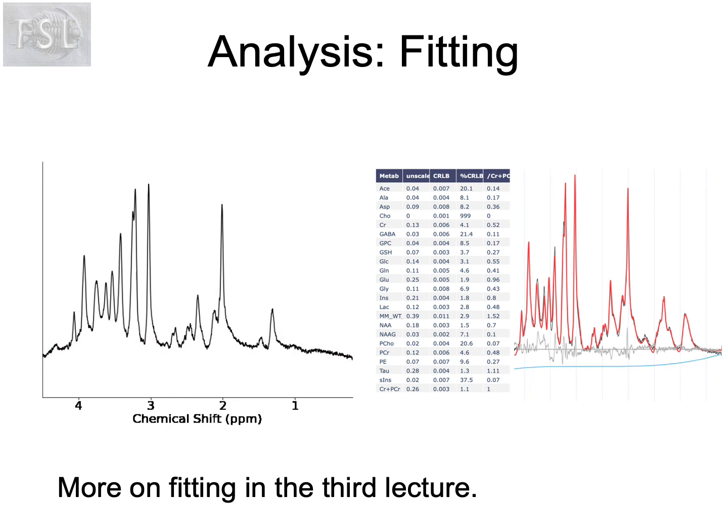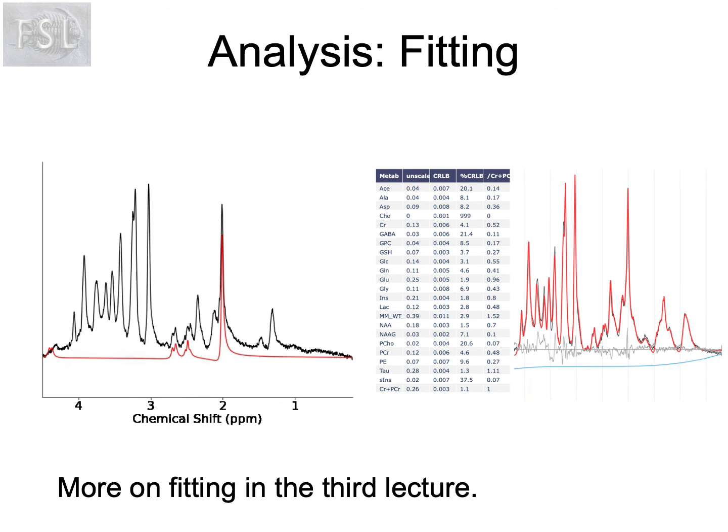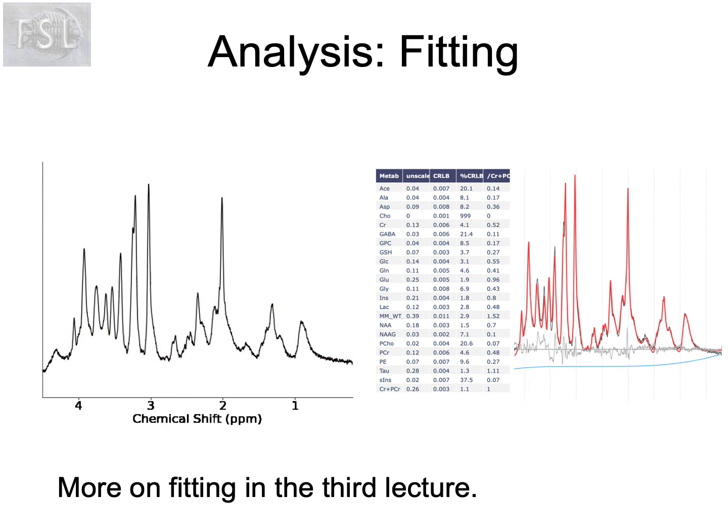After pre-processing, fitting must be carried out. And we see here a short animation showing the process of fitting simulated metabolite fingerprints or basis spectra to an in vivo spectrum. This is followed by a process of quantification, referencing either to other metabolites or to the water signal to generate concentration in meaningful units. And we'll look in much more detail at the fitting process in the third video.